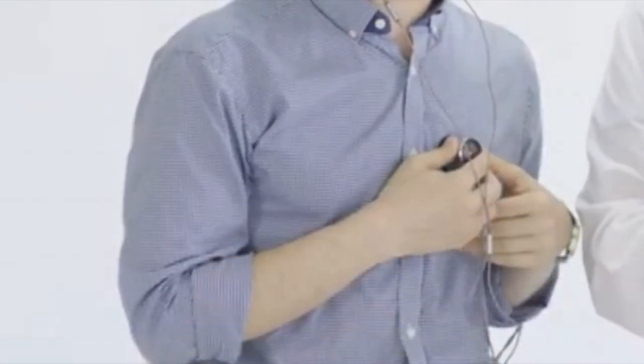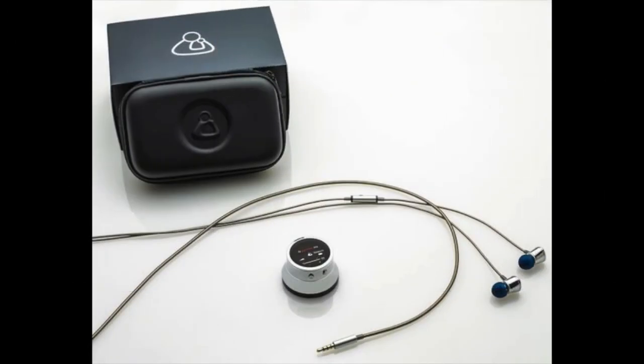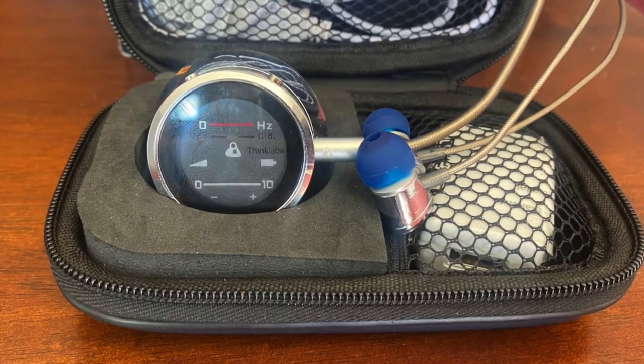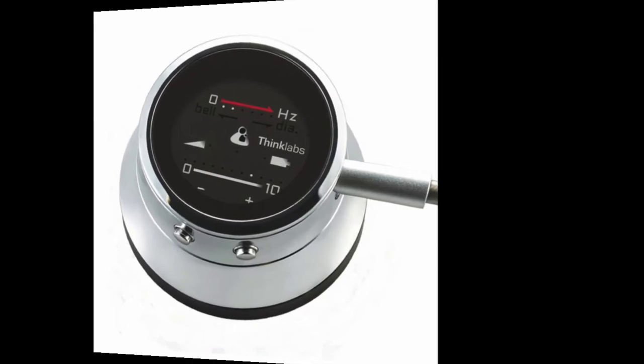This is how it may look when using the ThinkLabs stethoscope. As you just saw, the digital stethoscope works exactly the same as a regular stethoscope. The sound is just enhanced and it obviously is a little bit more high-tech. In fact, you wouldn't even know that someone may be using this device as an assistive technology tool unless they told you.